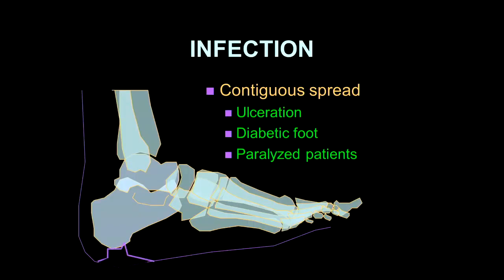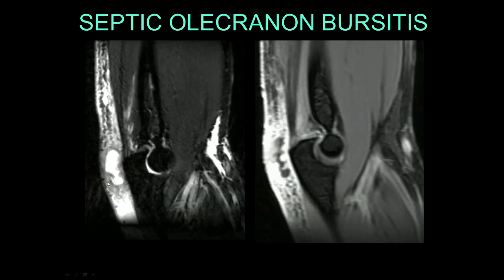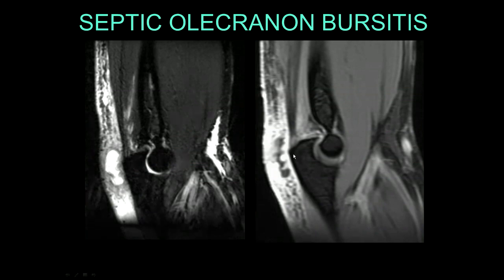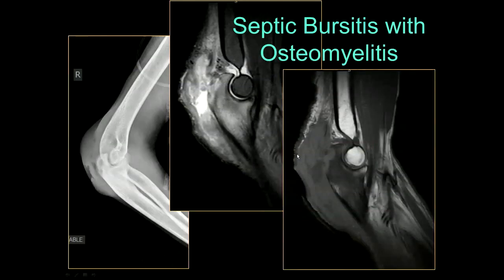Contiguous spread can also occur. We see this through ulcerations of various sorts, especially in diabetic patients and in paralyzed patients. Here's a patient with septic olecranon bursitis with fluid in the olecranon bursa at the elbow and surrounding inflammation. Notice there's no involvement of the olecranon. However, this can become more indolent, ulcerate, and involve the olecranon itself. In this case: septic olecranon bursitis, ulceration, and involvement of the olecranon.